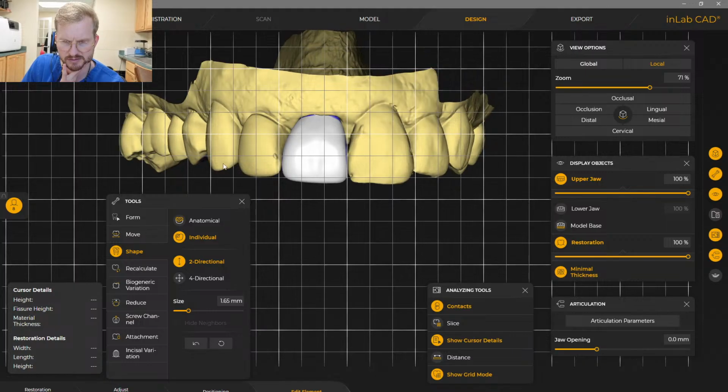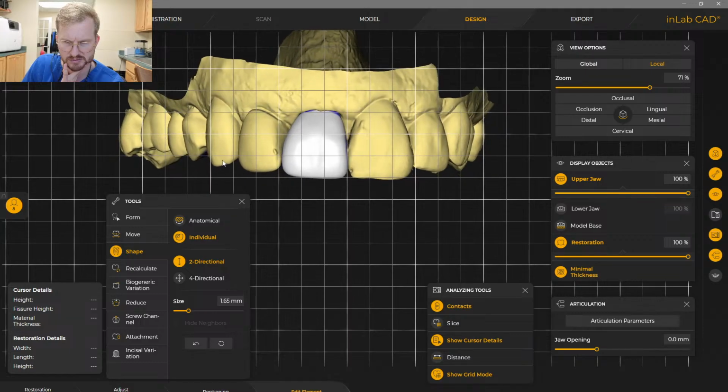It's like the laterals. And if those laterals were even, I look at my centrals. Like those okay. And when I deliver this, what I may do is take a polishing disc and just shorten this number 9 just a touch so that one, the incisal edge is more even, and two, it looks nicer next to my crown.